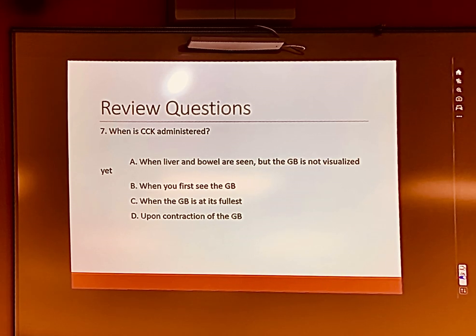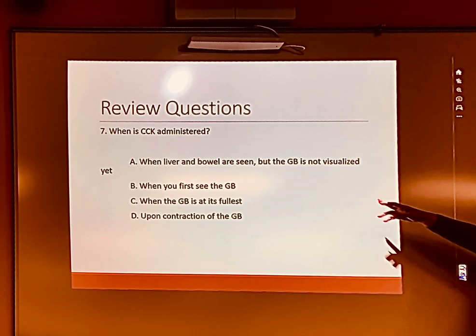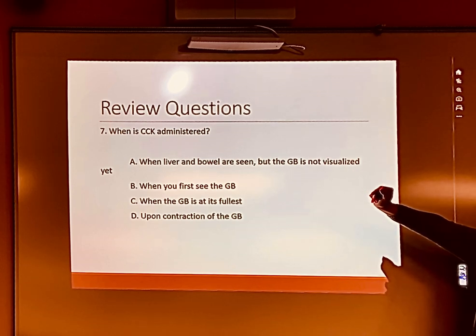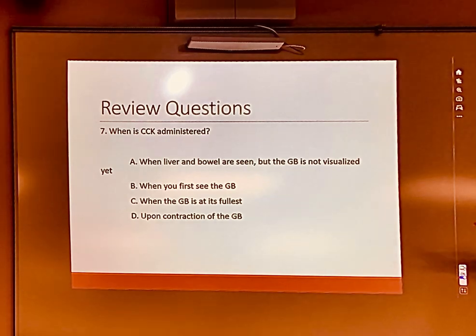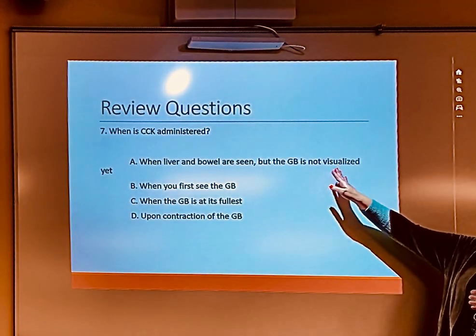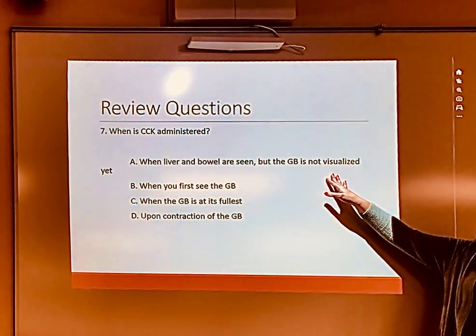So if you don't see the gallbladder, why would you give CCK? So C, when the gallbladder is at its fullest. Remember I was saying you want to make sure it gets full and try to get out of the ducts, the fullest it can be. Okay? Because you wouldn't give it at A because you haven't seen it yet. You've got liver and bowel, you haven't seen it yet.